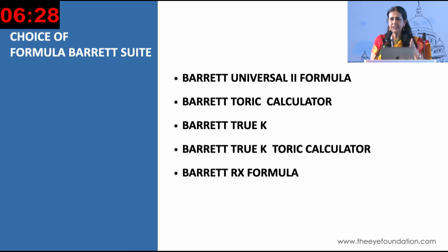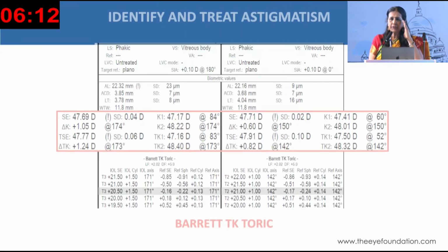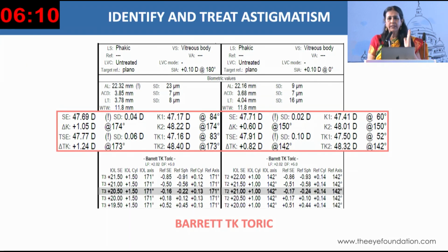It's essentially a thick lens formula, and it takes care of the regular universal or the toric, or it is used for refractive surgery or combined refractive with toric, or as an enhancement procedure. But whether it's Barrett or anything, it has to be a 4th generation formula where it's not only axial length and K value, but also anterior chamber depth and many more details coming in.